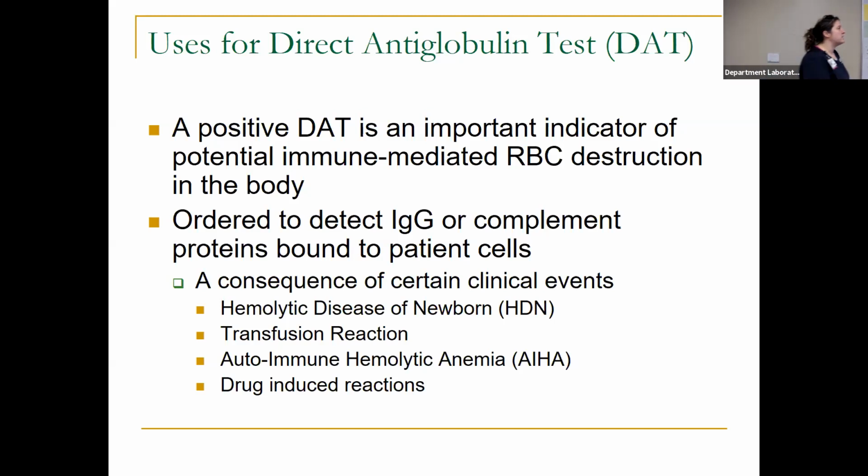Transfusion reaction. Let's say you're working up a patient and the patient had previously been identified with maybe JKA, one of our Kidd families. JKA is notorious for having a very low titer, often so low that blood bank cannot detect it. So if you don't have any history on your patient, then you might say your patient has a negative IAT. We're going to give them a cross-match compatible unit. Maybe it's JKA positive. All right, so what's happening? Your patient has anti-JKA, your donor cells are JKA positive. Your patient's anti-JKA is going to attack those donor cells.